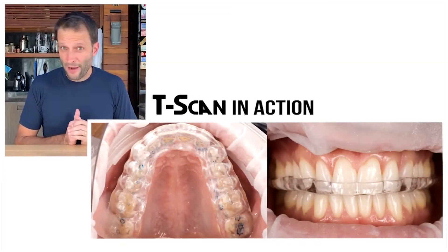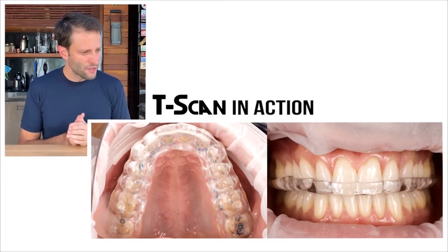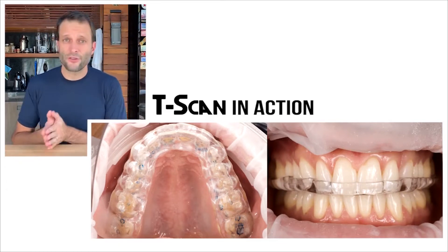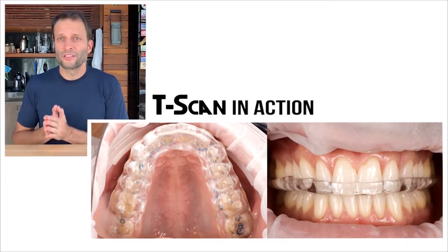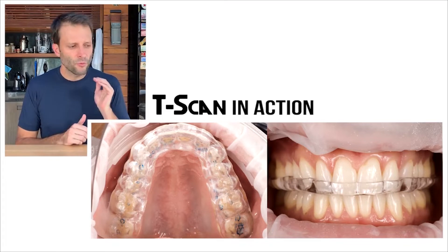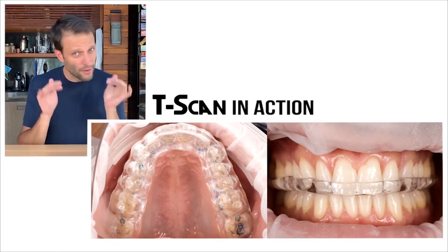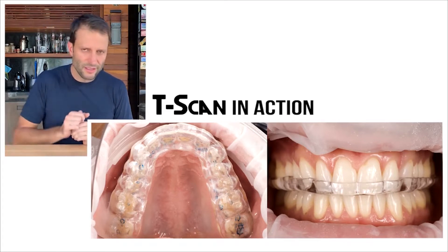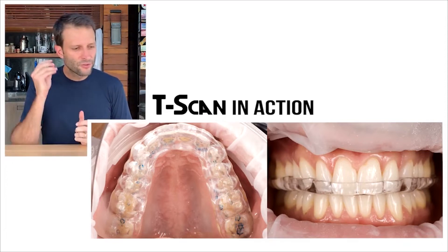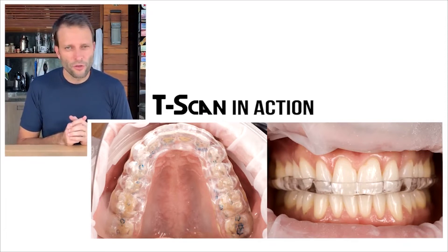Here you see my own mouth, and I'm utilizing T-scan to adjust a bite splint — that's actually another utilization of T-scan. As we put the bite splint in, we use the occlusal paper, we do the best we can to adjust, and then we use T-scan to fine-tune and improve the comfort, improve the bite to really hear that beautiful noise.